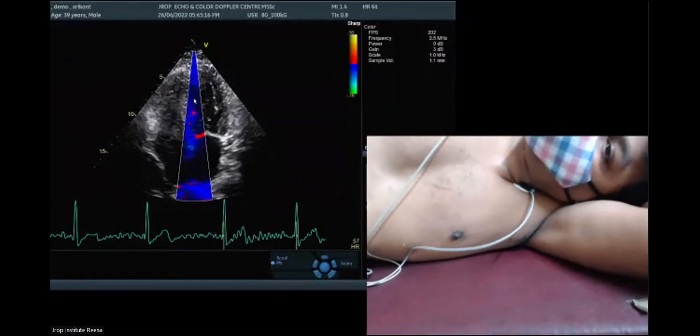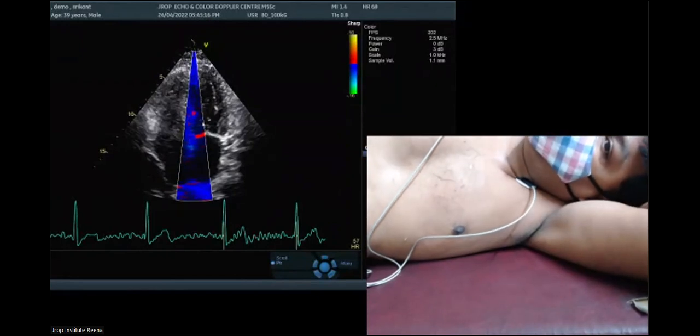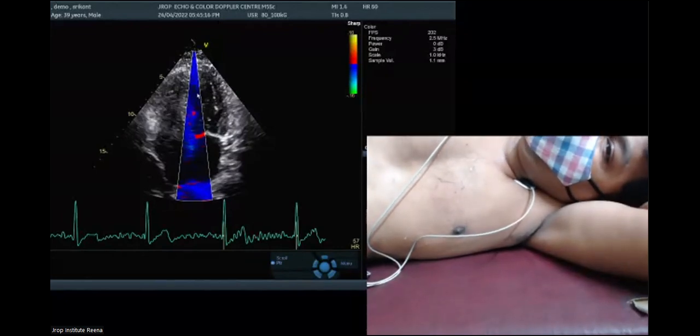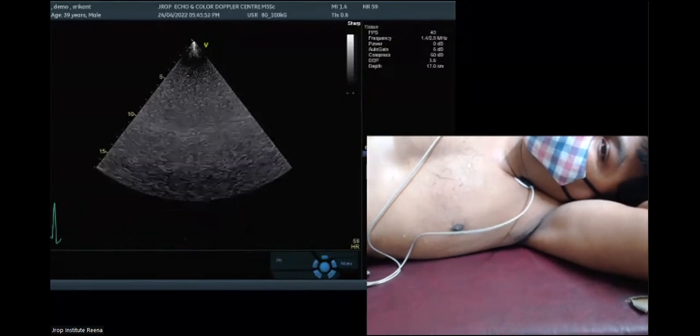This is tissue Doppler imaging. We have reduced the sector and are just concentrating on the septal annulus. Then we move to the lateral annulus and take the velocity. The thickening happens from this. These are upside down images. So the thickening happens, and these segments at the apex remain static. Mid and basal and other segments move toward the apex, each with their own blood supply. So the segments will go up as we do systolic function.